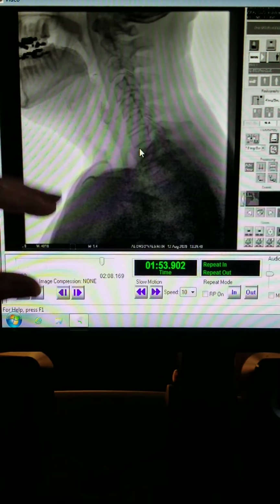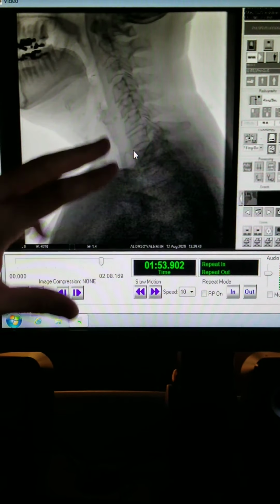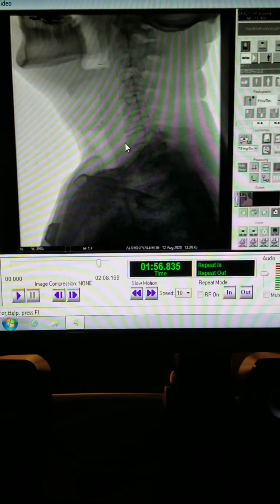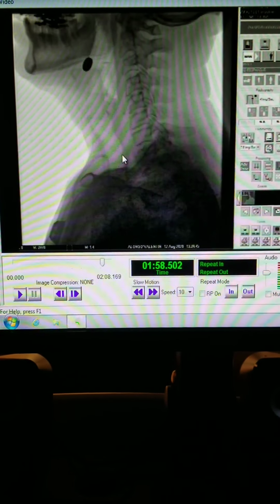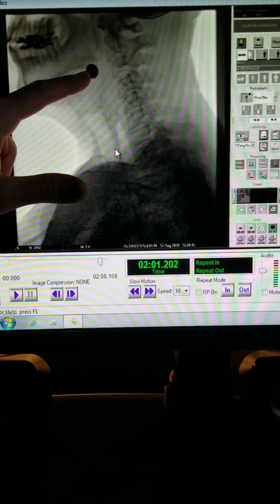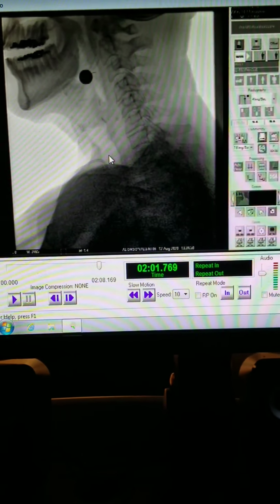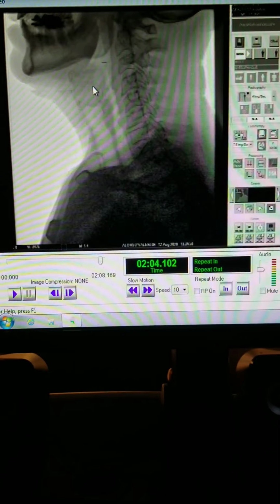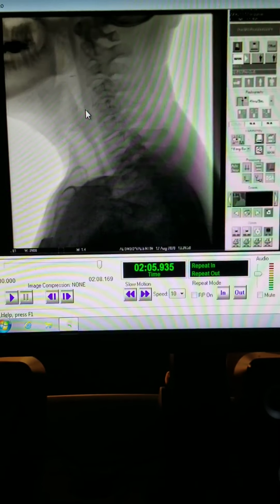Now, we're not going to see any barium because you use water, but basically that area is flushed out. Pill's still in your mouth, so you're still kind of struggling pulling that back. Eventually, you transfer it. It does get caught in here, which is something I would have expected because of the reduced flipping action of the epiglottis and some of that reduced base of tongue. But again, you just sort of persisted with the liquid and swallowing, and eventually the pill went down.